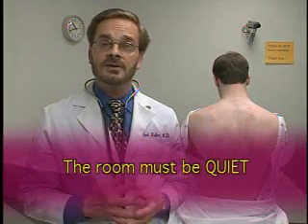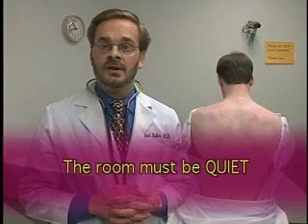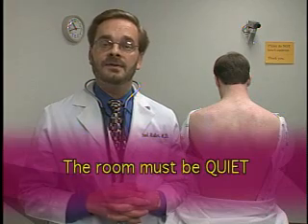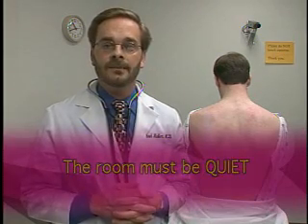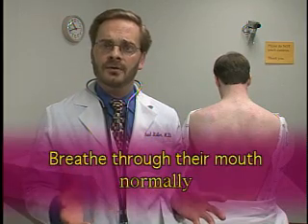The room, of course, must be quiet. There can't be extraneous noise from a TV or visitors or guests in the room. If the TV is too loud, turn it off or ask visitors to leave so you can do an adequate lung exam. Again, ask the patient to breathe through their mouth and just to breathe normally initially.